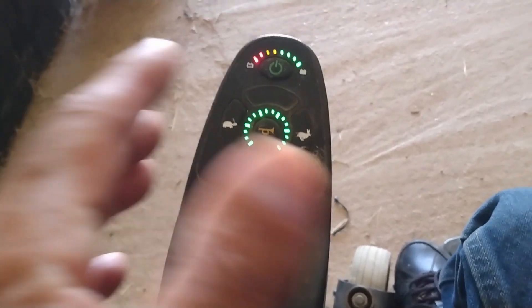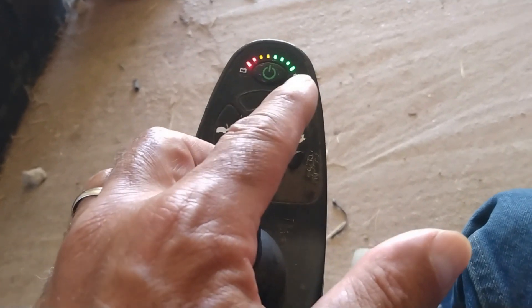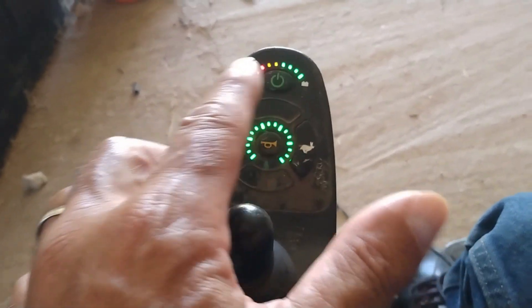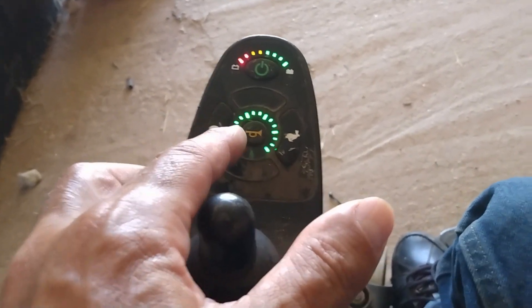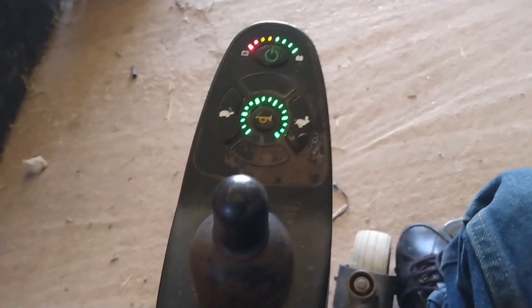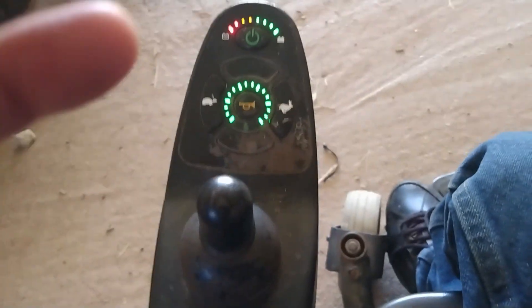So if your chair stopped working and the battery indicator lights are going back and forth, press the horn twice — maybe it works, maybe not. That's a quick tip for you. Thank you.